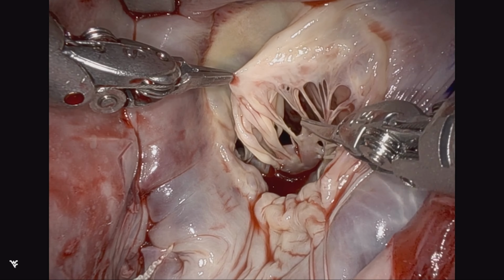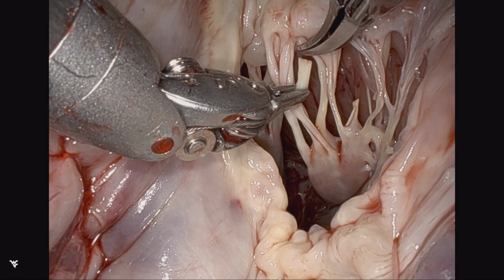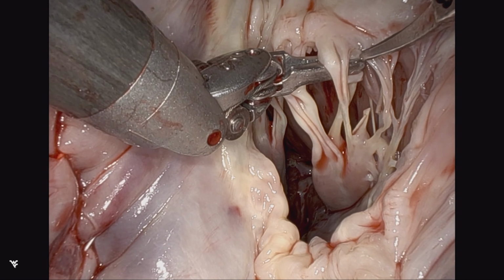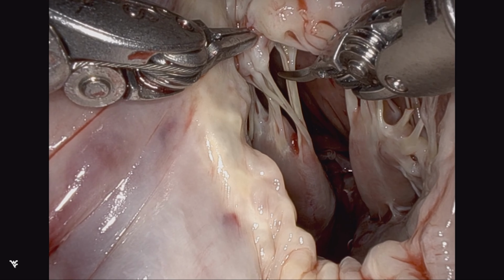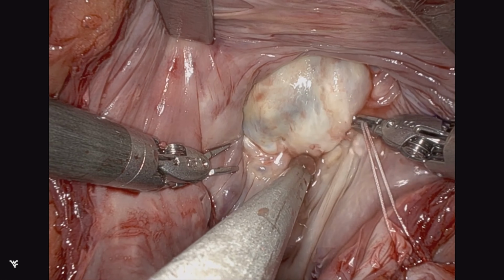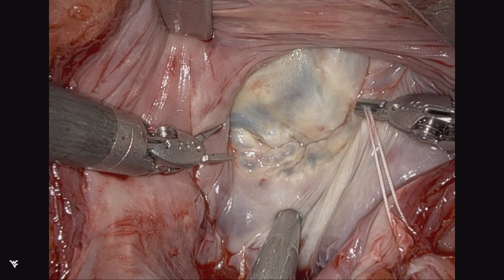As you can see, the posterior leaflet is somewhat tethered, but normal. And in this case, we're doing anterior chordal release and repositioning, while replacement, of course, is a reasonable option in patients with type 3 disease and very accepted. In some cases, it's not absolute, that one doesn't have to automatically replace. When the leaflet tissues are normal and the annular dimensions are reasonable and the degree of tethering is reasonable, it is absolutely possible and feasible to create a durable repair.